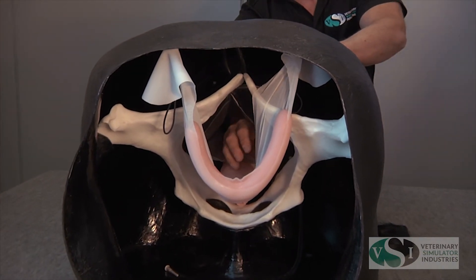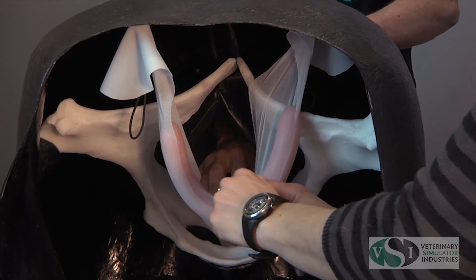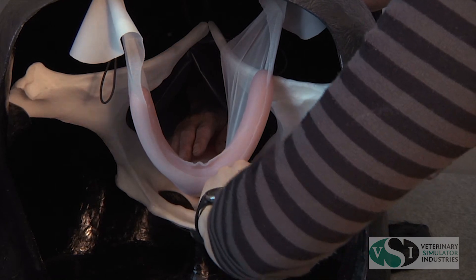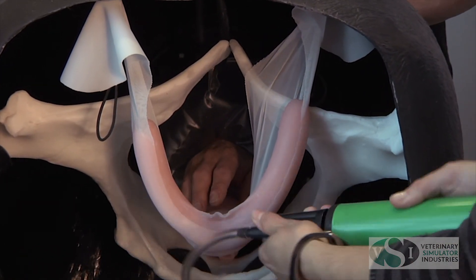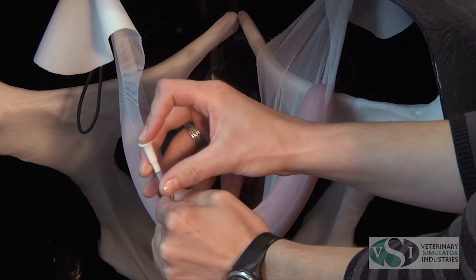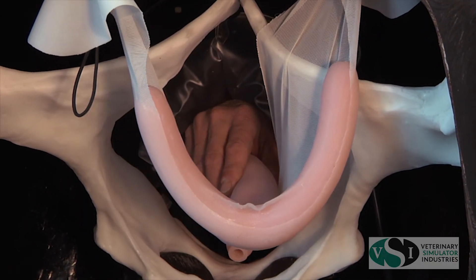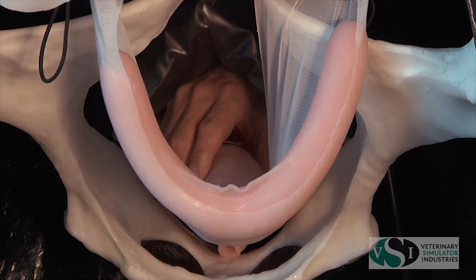During palpation demonstrations, inflate the rectum using the pump provided. This is designed to represent the pressure felt during rectal palpations.